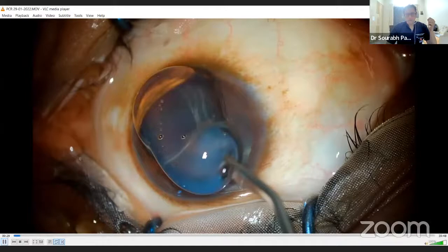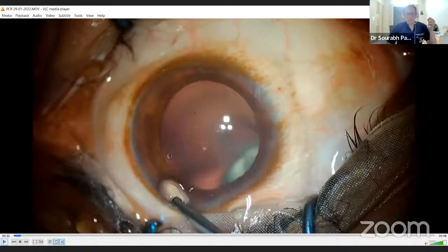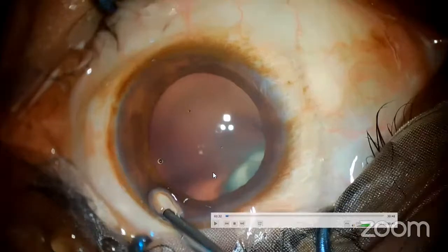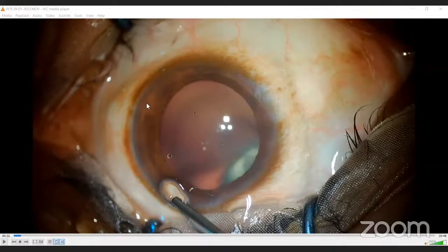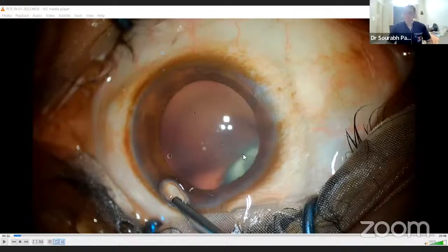So you can watch it. What is the observation in this case? Peripheral cataract. Yeah, so what you can see here is very dense opacity in this area only. Localized. Okay, such cases, because this is an unusual cataract, right? You don't see it in age-related cataract. This is definitely not age-related cataract because there are no cortical spikes anywhere else, just localized opacity.